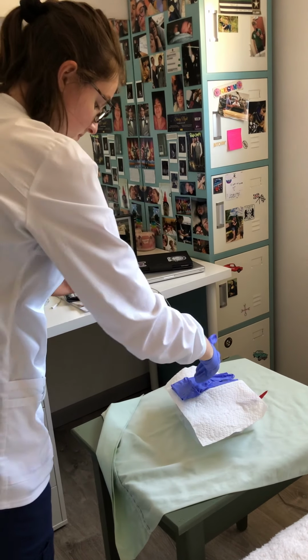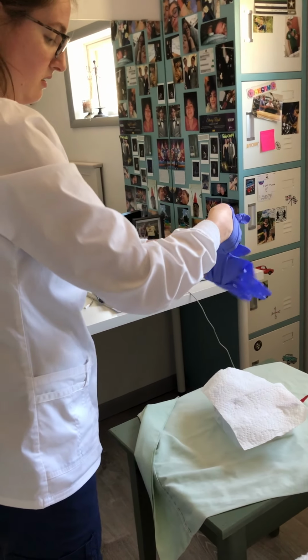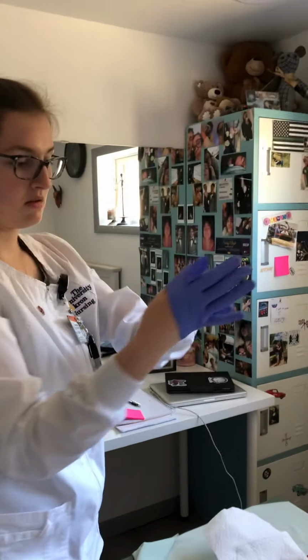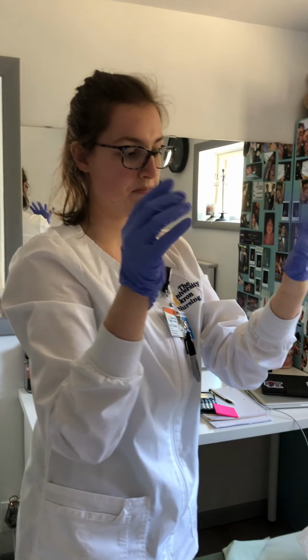We can fix that in a second. Okay, and you can go ahead and manipulate it. Okay.